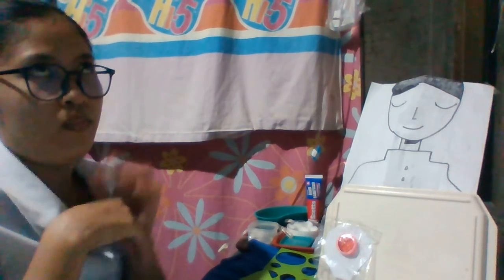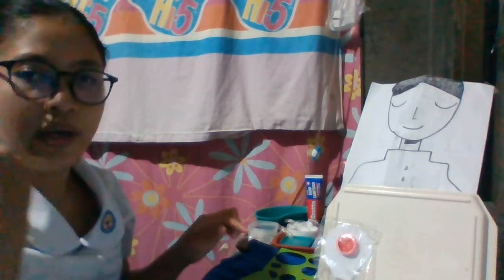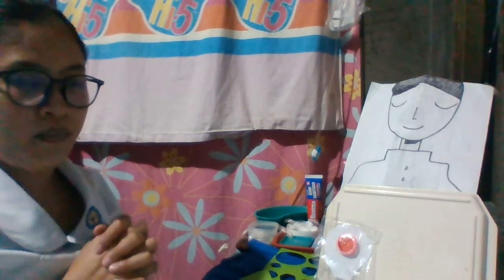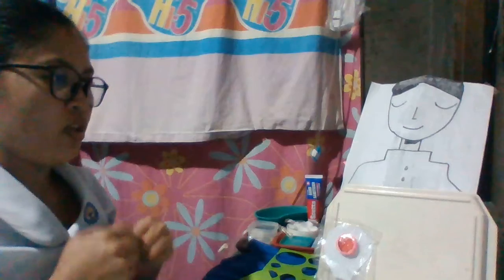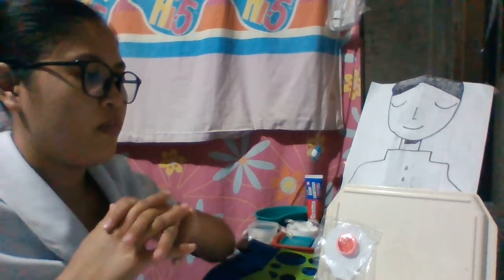So while I was removing it, the stoma and skin are just normal. Then for documentation, chart the type of pouch and skin barrier applied in the nurse's notes, then record the amount and appearance of the effluent in the pouch, size of stoma, color, texture, and condition of peristomal skin and sutures.